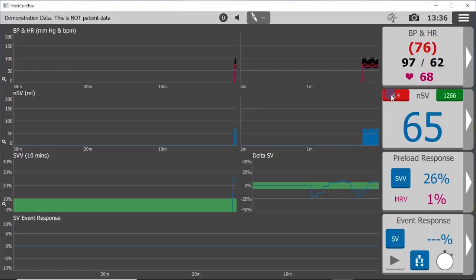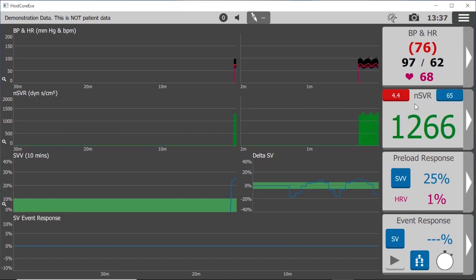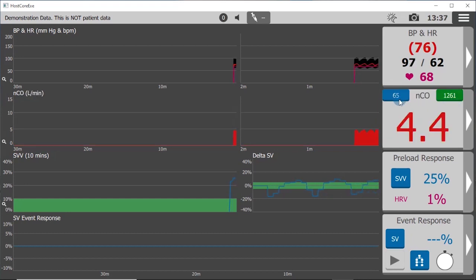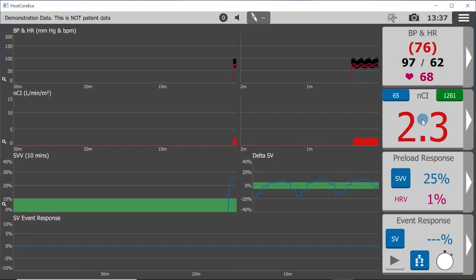stroke volume in blue, and systemic vascular resistance in green. Each can temporarily display an indexed value with the tap of the number, and will revert to the default in 10 seconds.